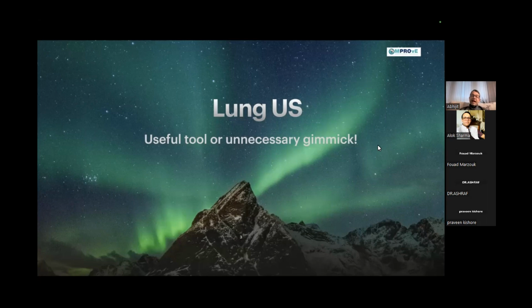Why do we need another diagnostic modality to diagnose the same diseases? I do not have to convince you, since you're already on the course to learn it. You are convinced enough that it adds to the information we are seeking in diagnosing and individualizing the care for the babies. And in terms of sensitivity and specificity, lung ultrasound outranks the chest X-ray. This is not me saying it.